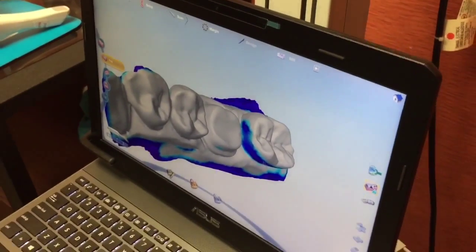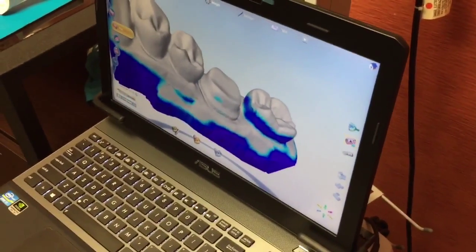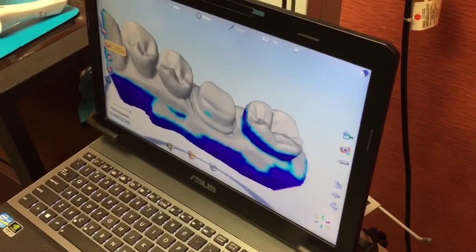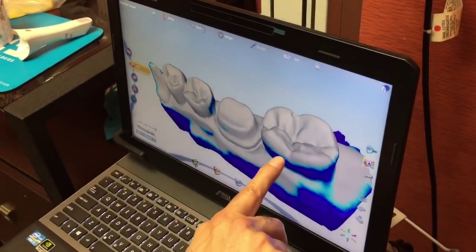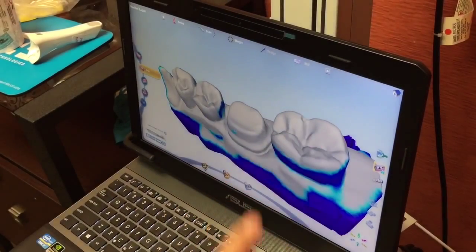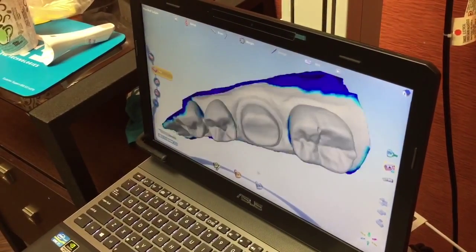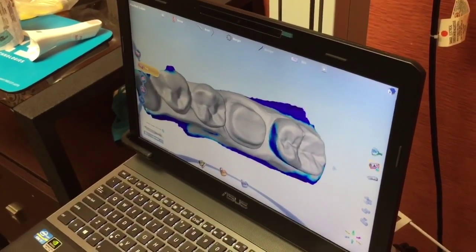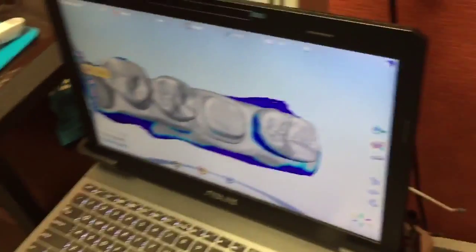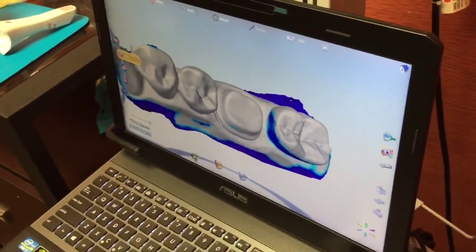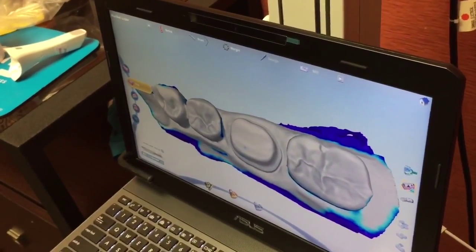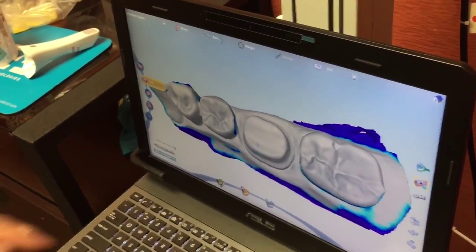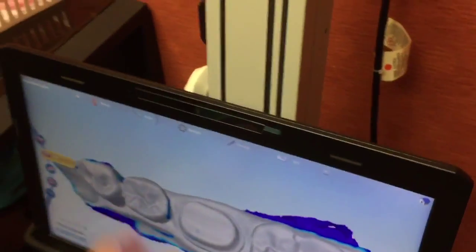So one way to check to see if you have data, it's called data density, density of the data. You click on this icon, it shows you where the blue is where you missed the data. So that means I have to go back and capture this data. Otherwise, when I'm in the design phase, your crown is going to be jacked up. Because the computer doesn't know when it's designing. So I know that I have to go back. I only care about these two teeth. I don't really care about here. I need, I care about my contact and occlusal surface. So I want to make sure that I, and I missed a little bit on the prep. So I know I need to capture the mesial of number 31 and this tooth, because I missed the data.